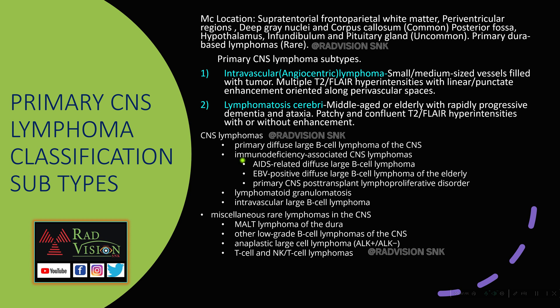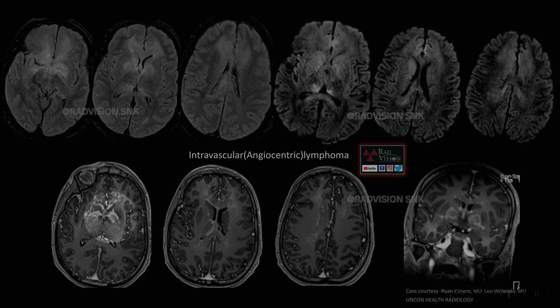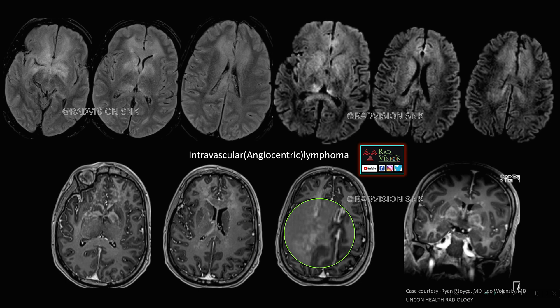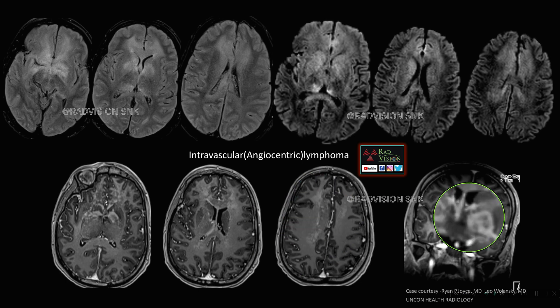Two important lymphoma variants: intravascular or angiocentric lymphoma shows a lesion hyperintense predominantly in the capsulo-ganglionic region with patchy restricted diffusion on DWI. On IV contrast, there is punctate or linear enhancement along the vessels and enhancement along the perivascular spaces. This is classical of intravascular angiocentric lymphoma.